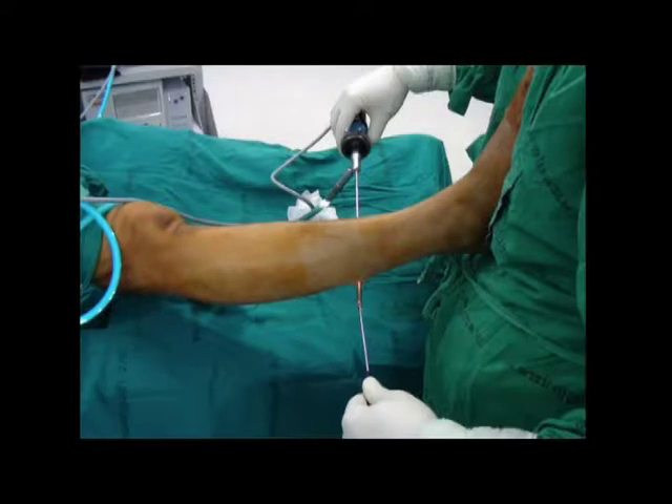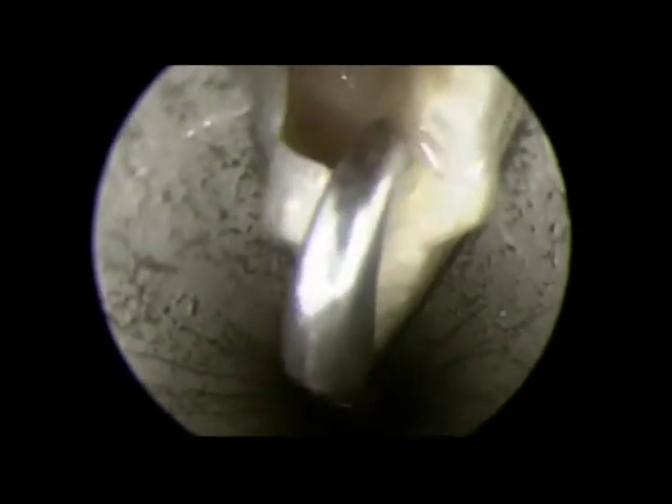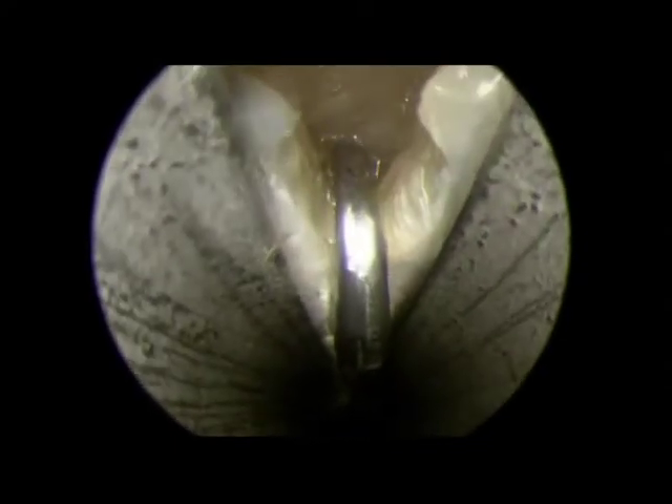For cutting the fascia, a retrograde knife is introduced from the lateral portal under endoscopic control. The knife is hooked from the medial side of the gastrocnemius fascia and the cut starts from the medial side. The process of the cut should be gentle and smooth. You can observe the thickness of the fascia and also the whitening and atrophy of the gastrocnemius muscle.